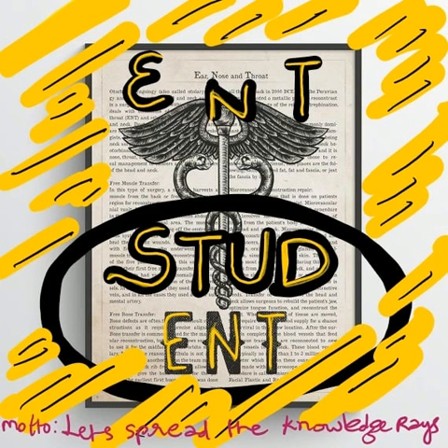Now change to a diamond burr, or it may fracture the dural plate, creating a dural dehiscence. Reaching the dural plate is identified by a change in the color of the bone and a change in the sound of the burr vibrating on it.